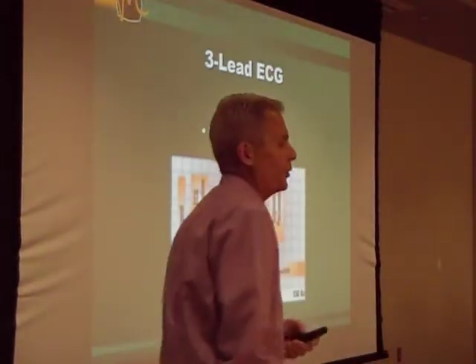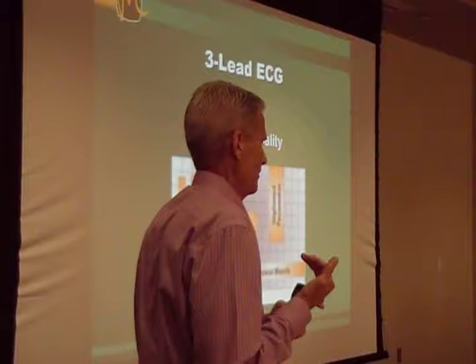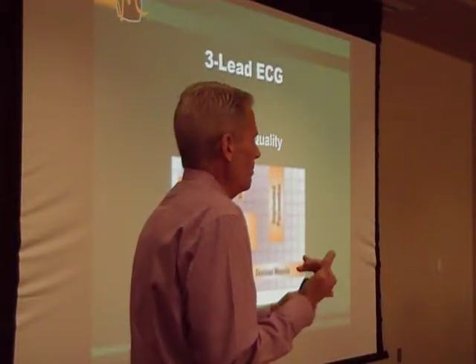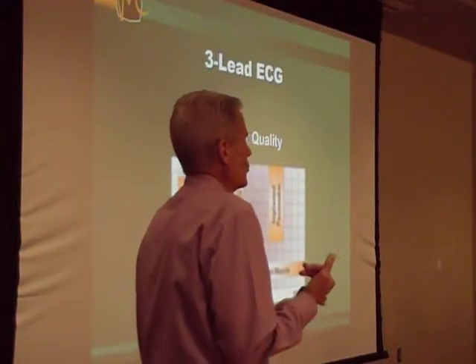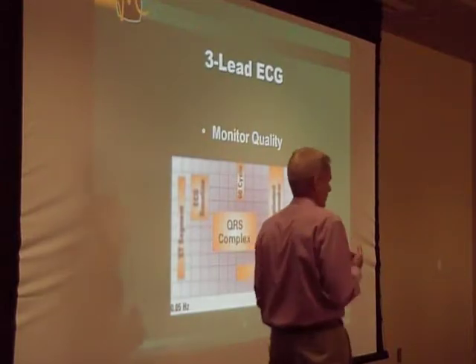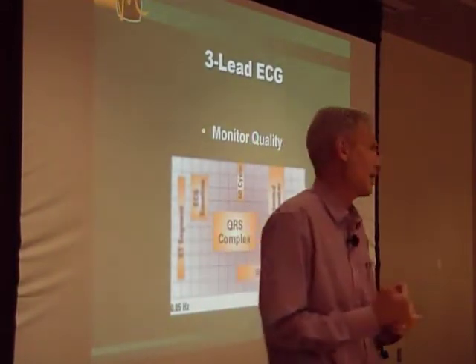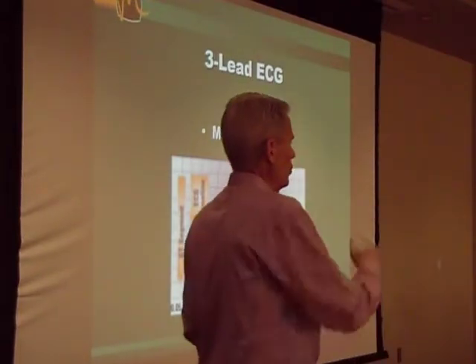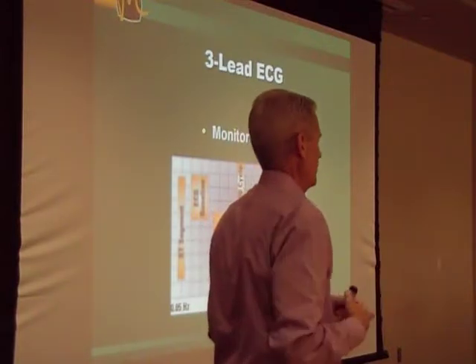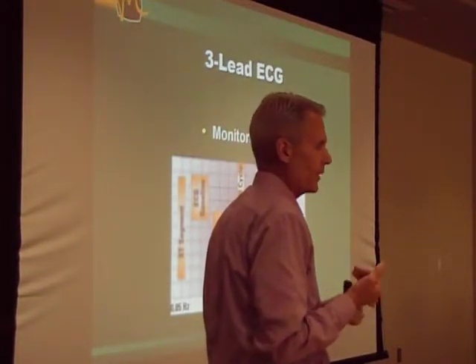So I want to talk a few minutes about frequency response. Remember I told you your 12-lead device is a voltmeter. It measures electrical activity within a certain parameter. Now, when you go on runs or you're monitoring patients in the hospital and you put the wires on and you just want to do rhythm interpretation, you want to see what rhythm they're in, most often monitors are in what's called monitor quality.